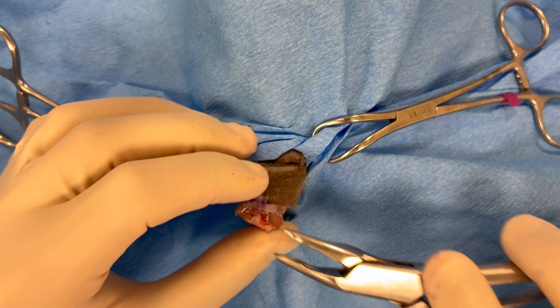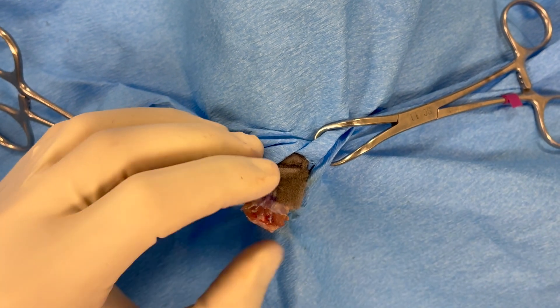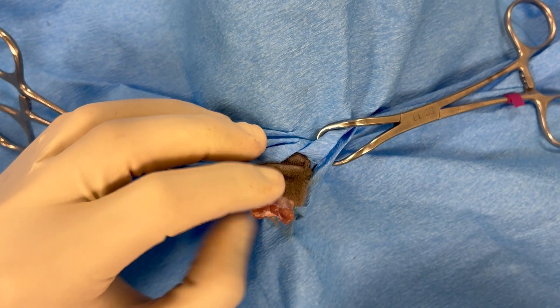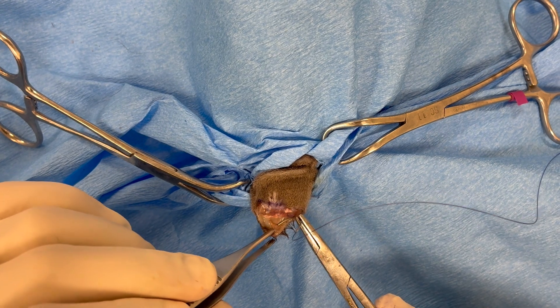Upon complete amputation, the vessels are typically identified at this point and cauterized off. Any sharp segments of bone can be removed with a rongeur or a bone cutter.